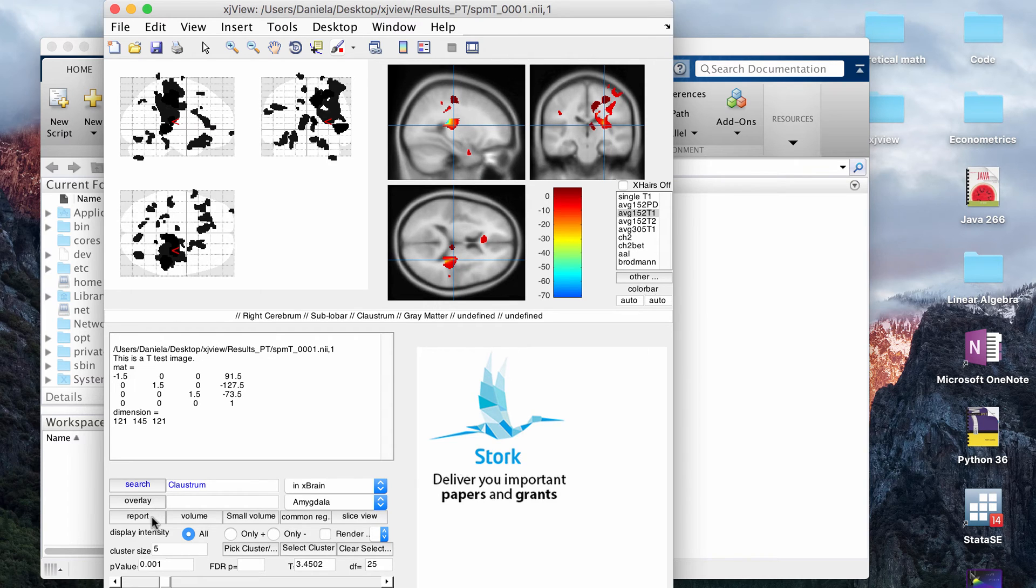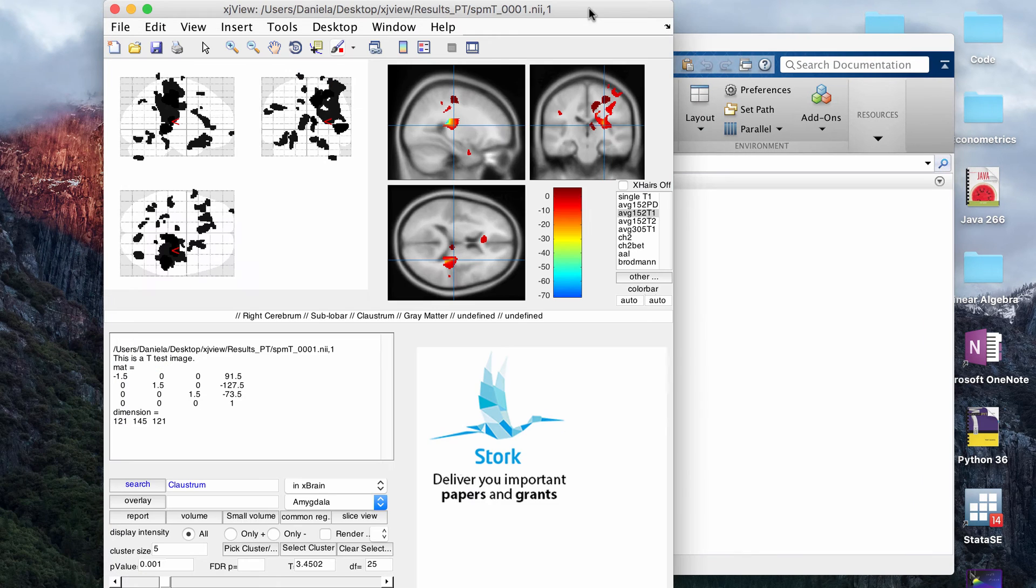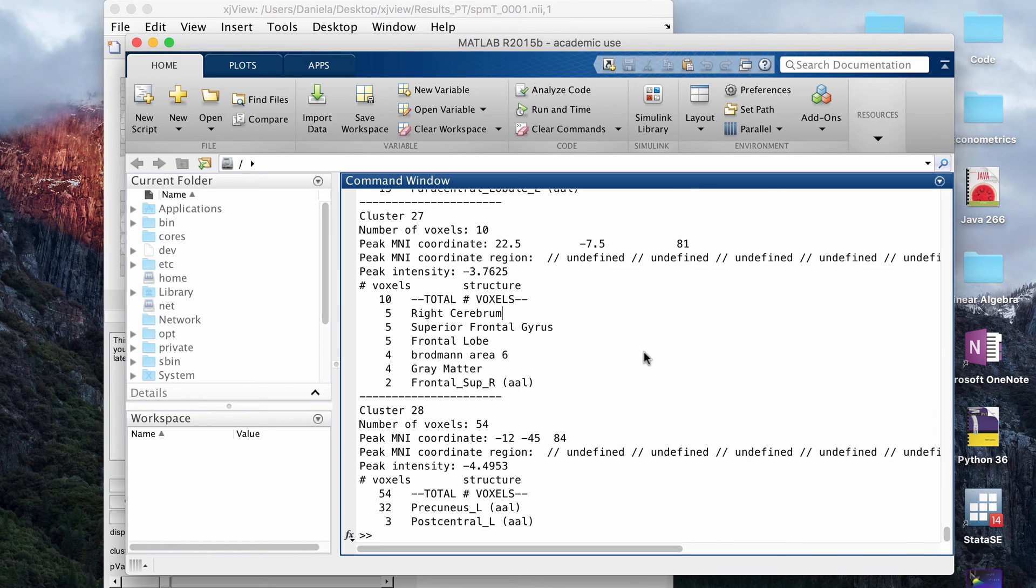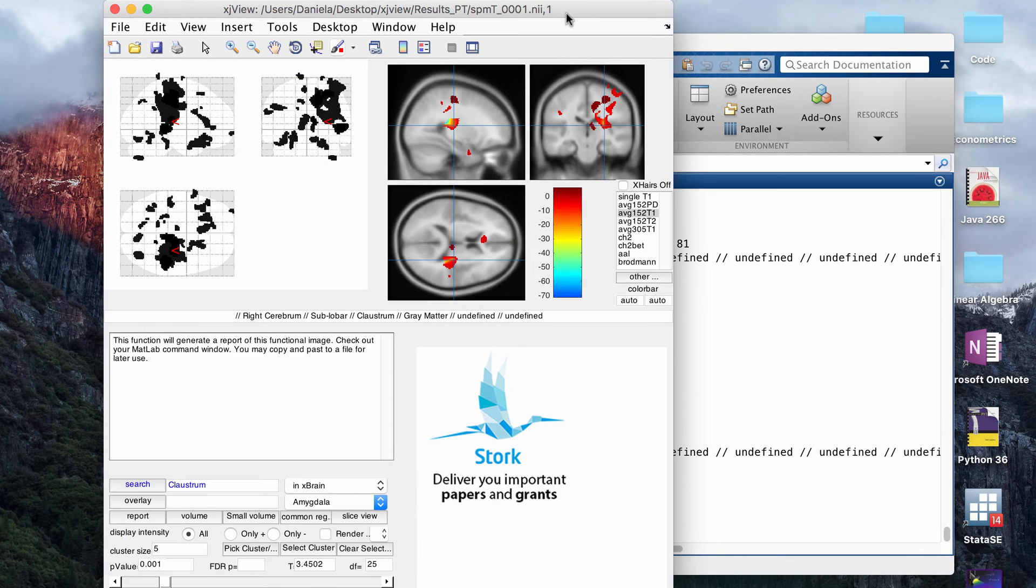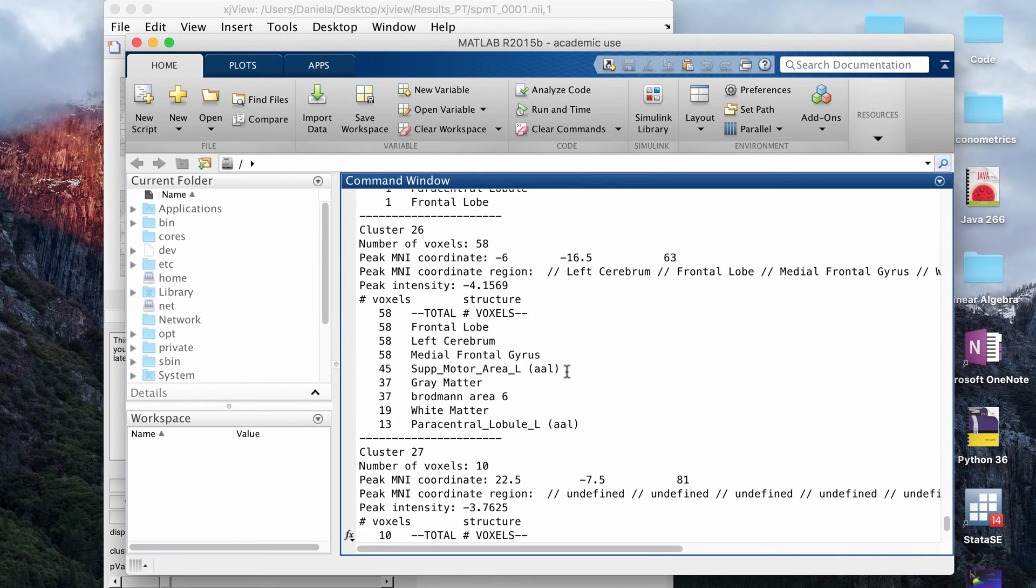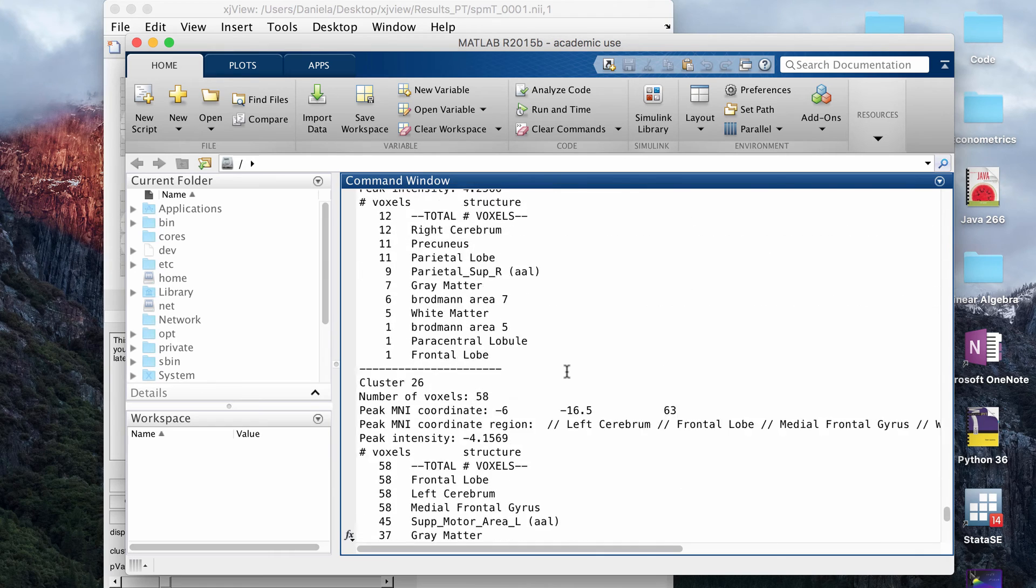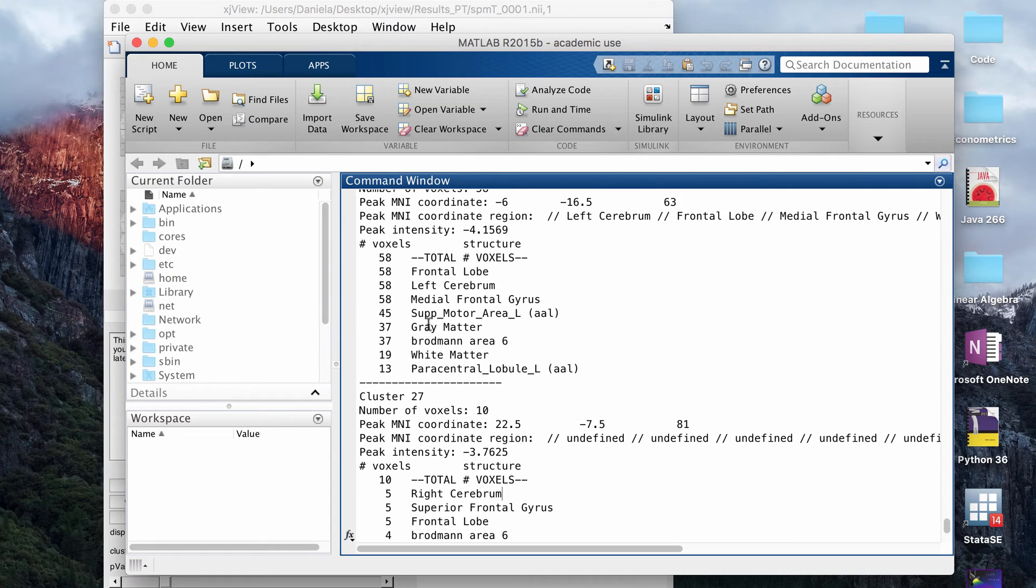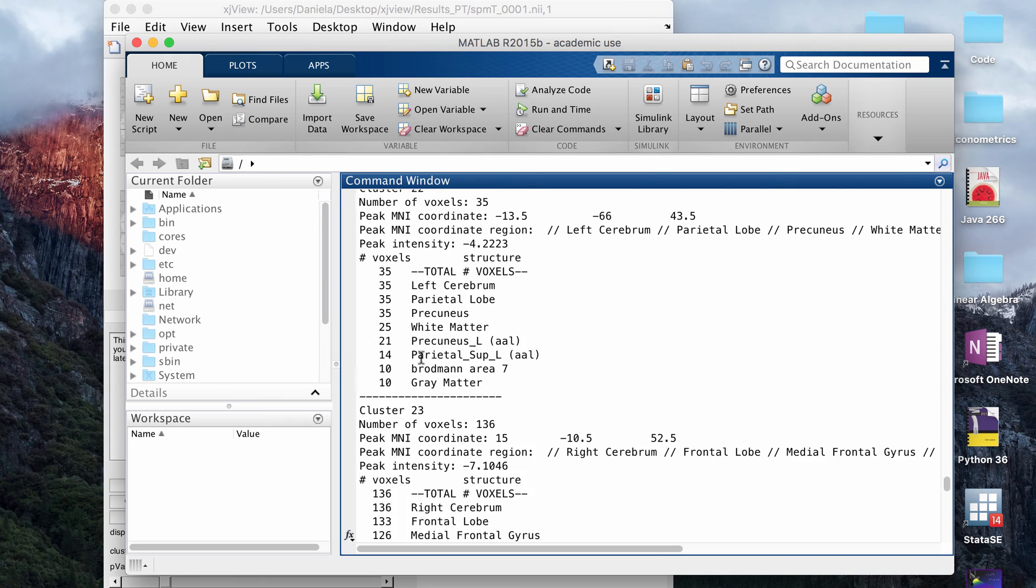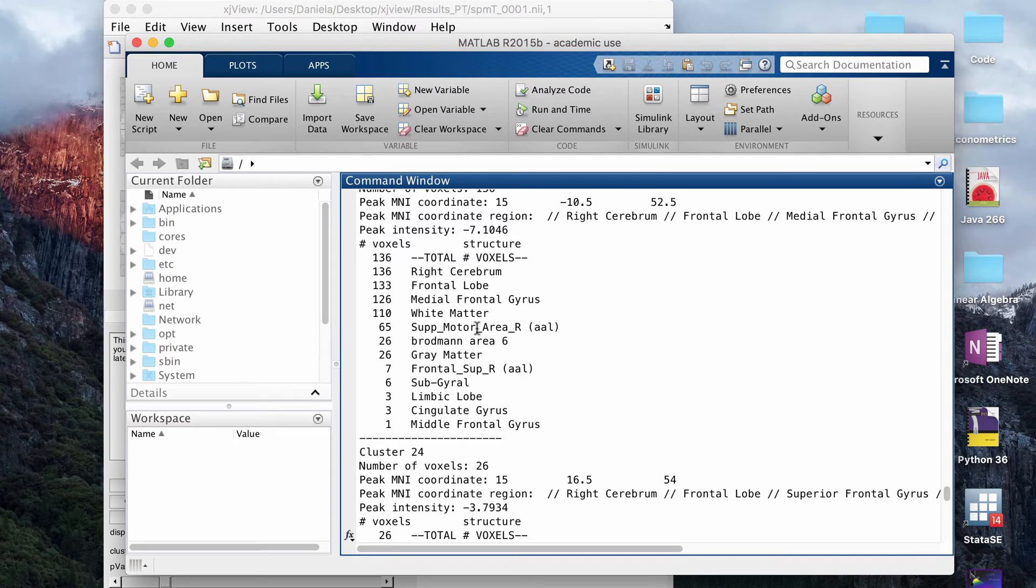There's a button here that says report. I'm gonna move this window over a little bit so you can see. When you click report, it will generate in the MATLAB command window a report of all the clusters. When I open it, it tells me that there are 28 clusters based on the stats that I have now. I'm gonna talk about that later, but let's just go to this window. It gives you information about each cluster that it's recognizing. It tells you the number of voxels in each cluster, the coordinates of the cluster, and then it will give you the anatomy information that I was talking about for each cluster. That's really nice. It will tell you that these clusters are...let me find a bigger one, for example. This one is 136, and this is mostly in the superior motor area on the right, amongst other things.